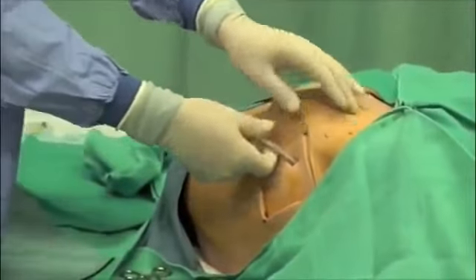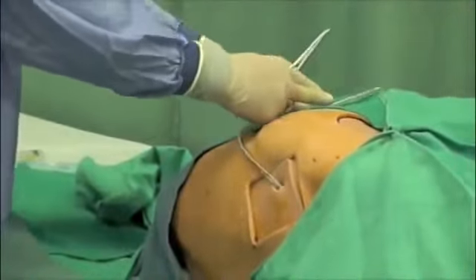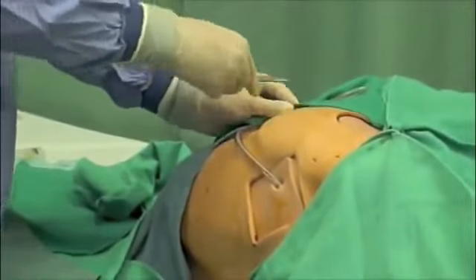Ensure all drainage holes are within the chest cavity. Look for fogging of the chest tube with expiration and listen for air movement.